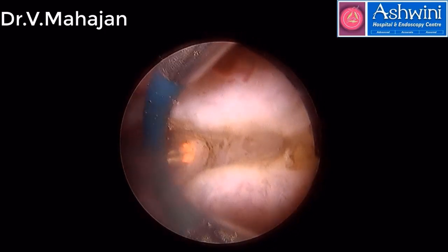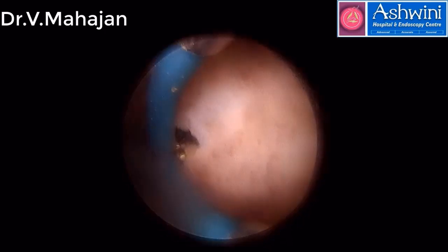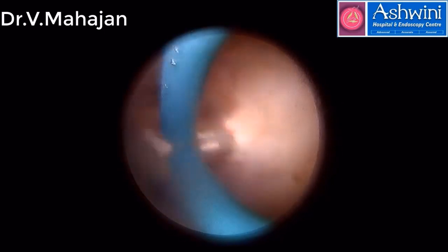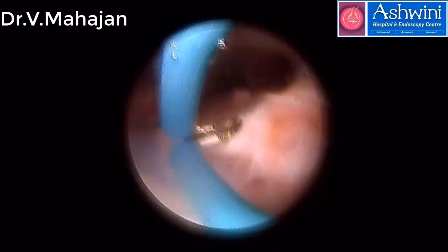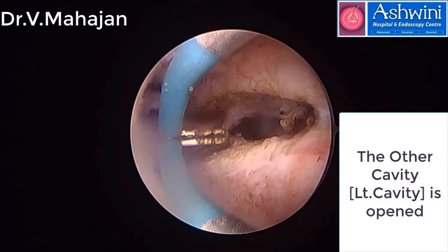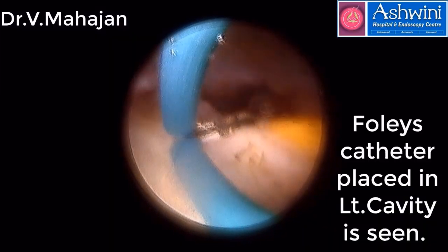So I am cutting the intervening wall, and here I have opened the cavity. We should be able to see the Foley's. The Collins knife is usually 2 to 3 millimeters. There we open the cavity. You can see the Foley's also.